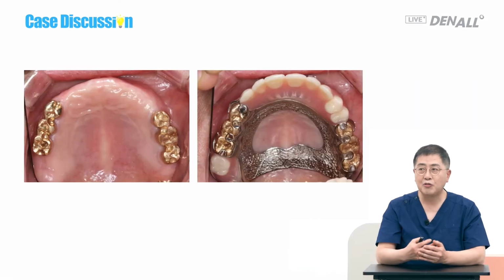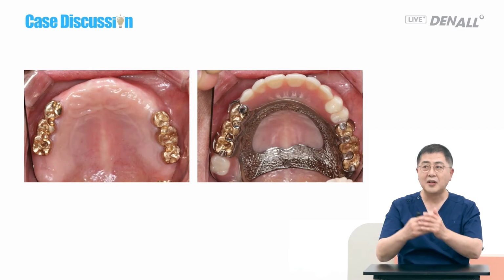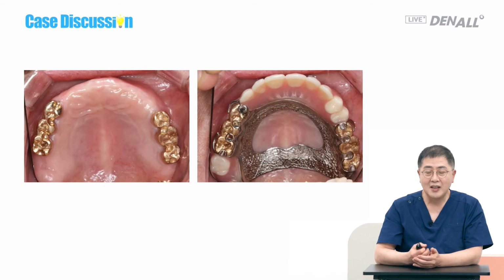At that time, I had never seen a case where an implant is used for a surveyed crown and denture. And the denture was made like this, but I couldn't show that to anyone else because it was not a common procedure. But now it is becoming popular, so I'm introducing my old case like this.